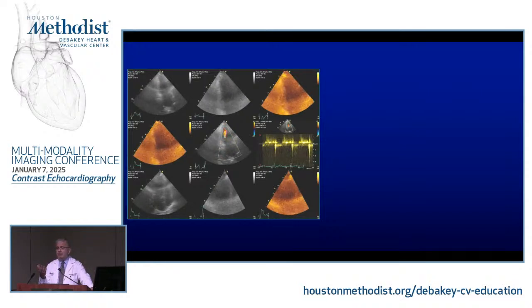And it brings me to a point where you, as future leaders of echocardiography, and you don't have to be a leader, you're going to be a utilizer of echocardiography. Unfortunately, and this is reality, I could interpret this study very easily to say, technically difficult study, I cannot interpret ventricular function, or I can invent a number. This is not what you want, right? This is what quality is about.